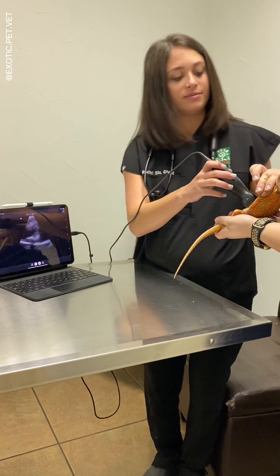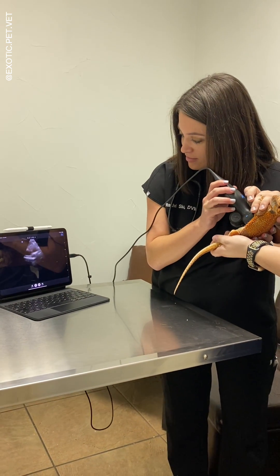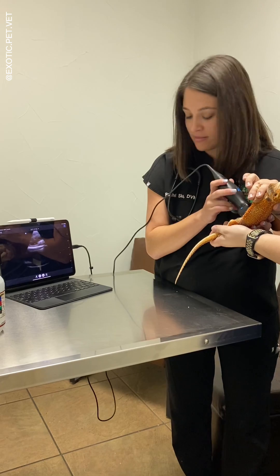Although I didn't show it here, it can even do color Doppler. Although it's hard to see in the video, we did see follicles on this bearded dragon.